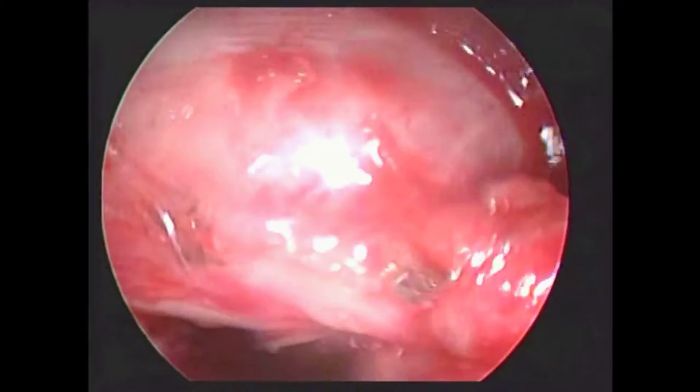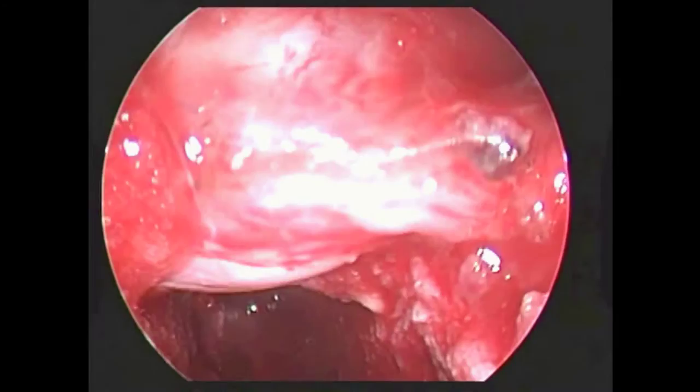First, a zero-degree endoscope was used for visualization of the disk space close to the thecal sac. Curettes were then used to remove the residual disc material.